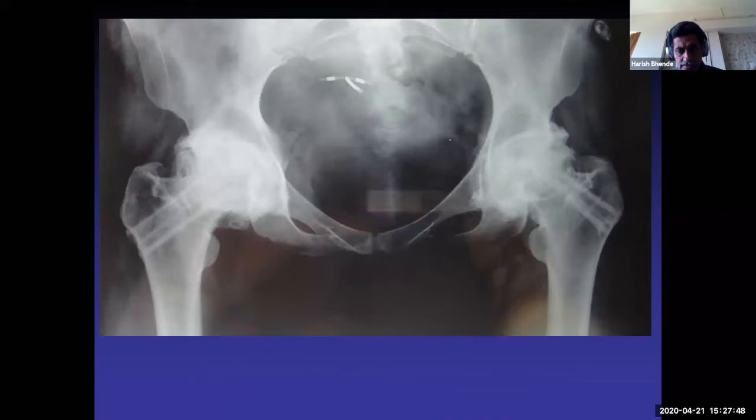Now, just a case example of a patient. A patient has AVN and a surgeon has put a fibular graft on both sides, which is a quite accepted standard technique of trying to treat AVN in a young patient to prevent further collapse. And the collapse continues, the patient gets secondary arthritis and requires a hip replacement surgery.